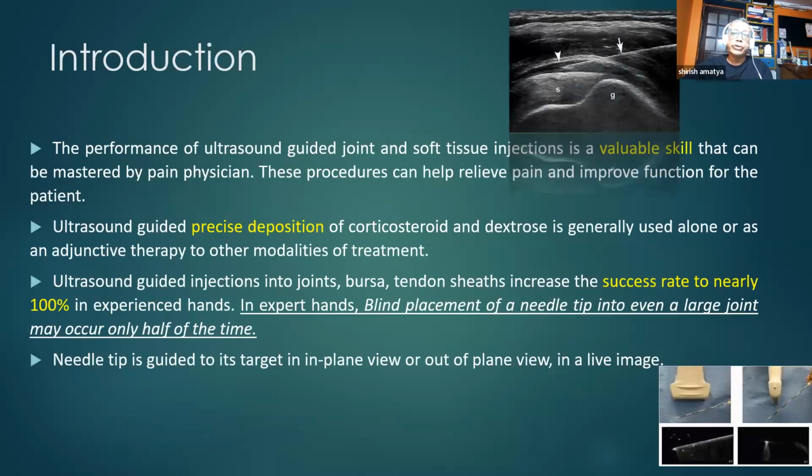Coming to the introduction of this topic, the performance of ultrasound guided joint and soft tissue injection is a valuable skill that can be mastered by any pain physician. And these procedures can help to relieve pain and also improve function for the patient. The ultrasound guided technique helps in precise deposition of the drugs, especially corticosteroid and dextrose, and it can be used alone as a monotherapy, or in adjunction with other therapy for the management of pain.